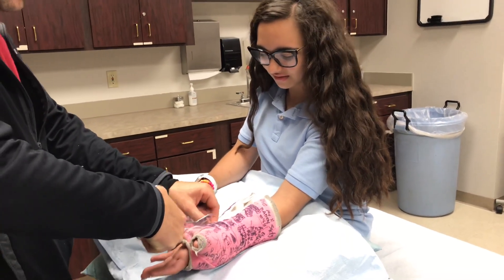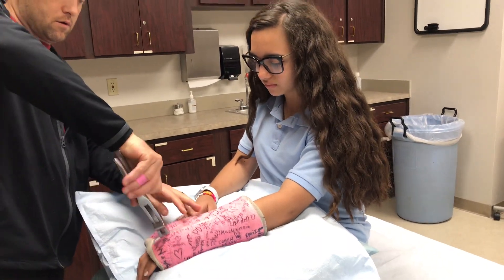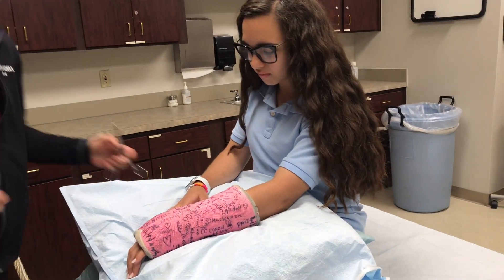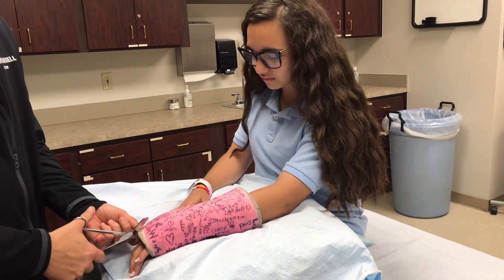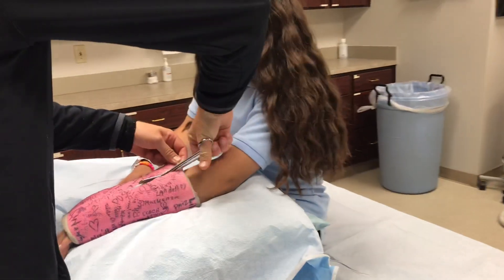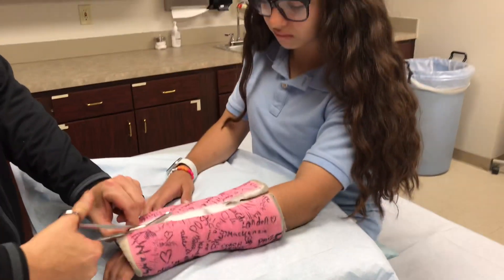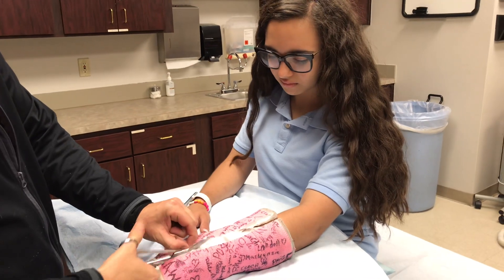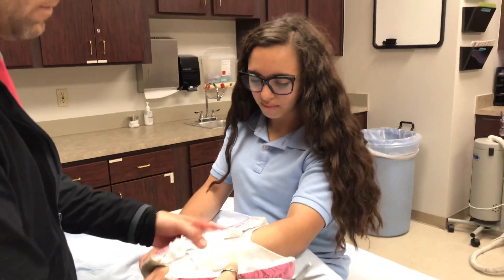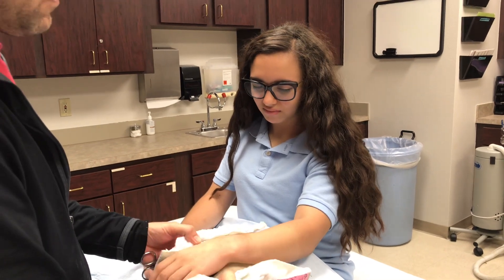Is that pulling on you? Rotate back over for me, on the other side. Now those are kind of sharp. You're free.